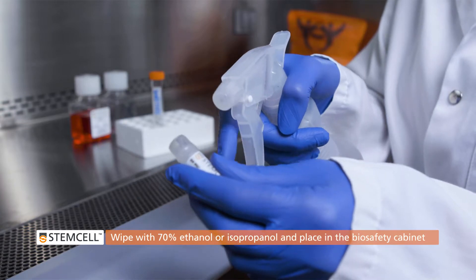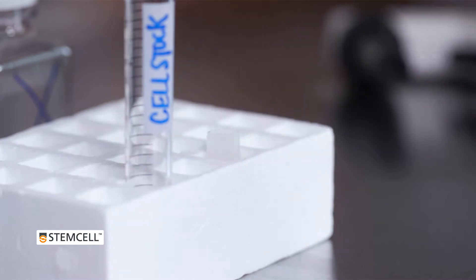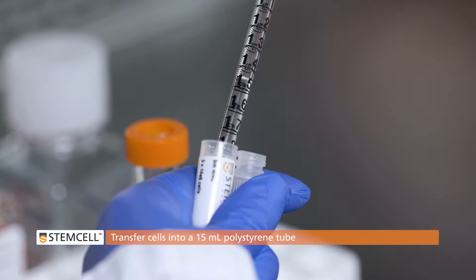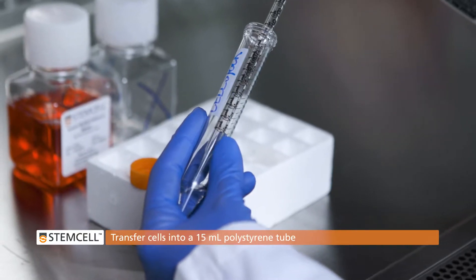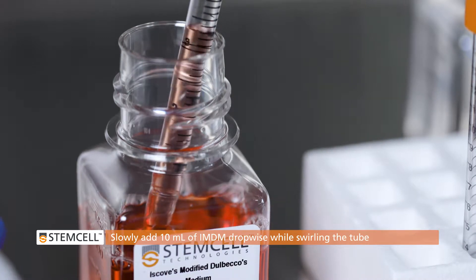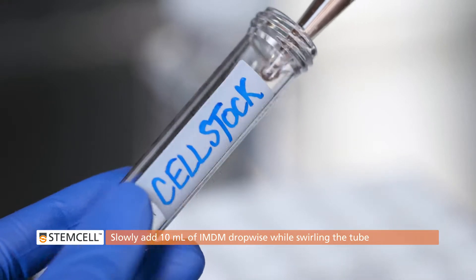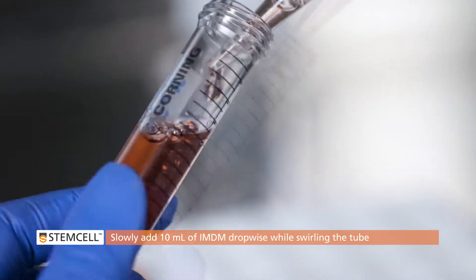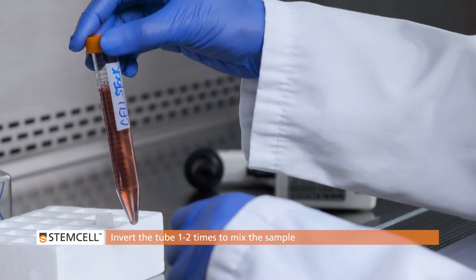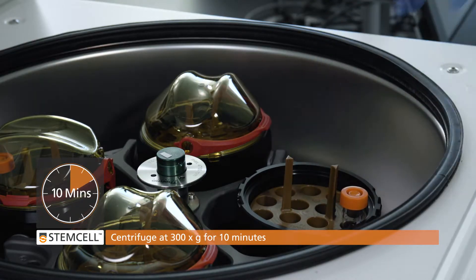Wipe the outside of the vial with 70% ethanol or 70% isopropanol and place it in the biosafety cabinet. Using a 2 mL serological pipette, gently transfer cells into an empty 15 mL polystyrene tube. Slowly add 10 mL of IMDM dropwise while swirling the tube for approximately 1 minute. Be sure to add the medium slowly as the cells are fragile after thawing. Invert the tube 1 to 2 times to mix the sample, then centrifuge at 300 times G for 10 minutes.